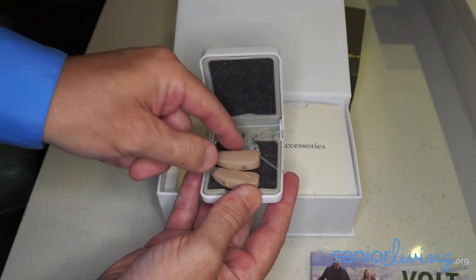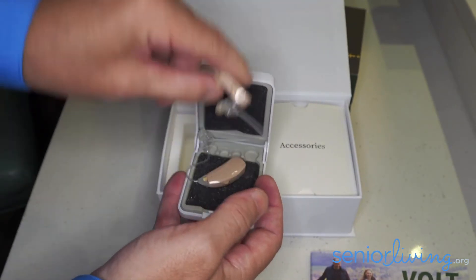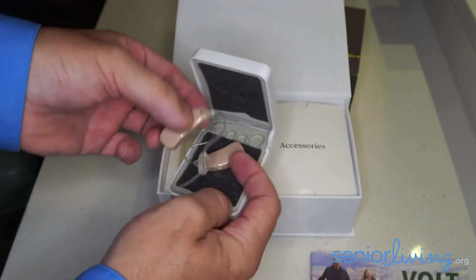These are a rechargeable hearing aid, so you'll see these little contacts on the bottom — those are for charging. This hearing aid is what we call a thin tube, so there's a little sound tube that comes from the hearing aid down into the earpiece.